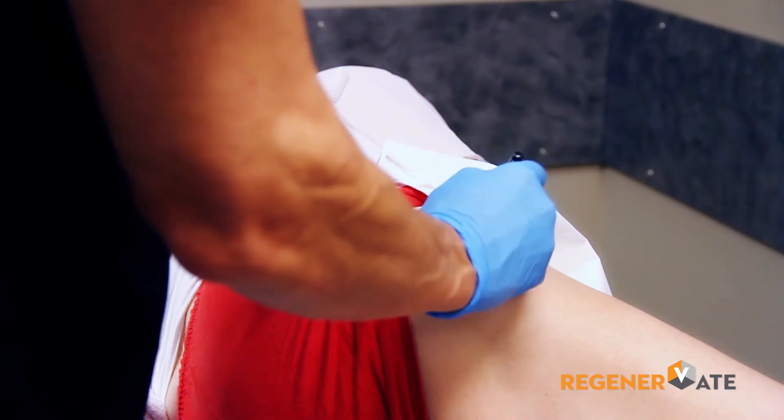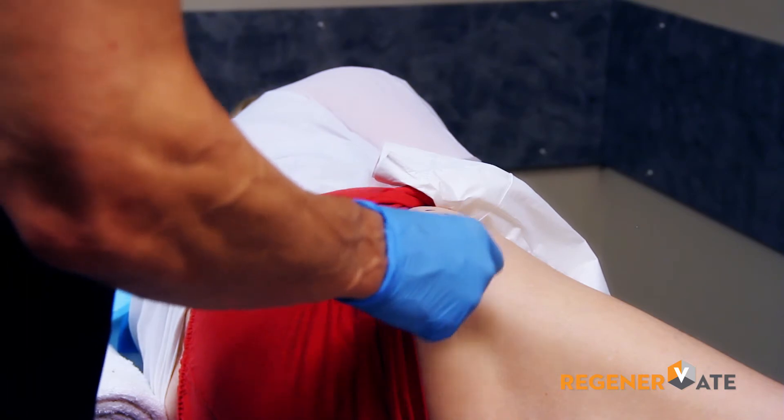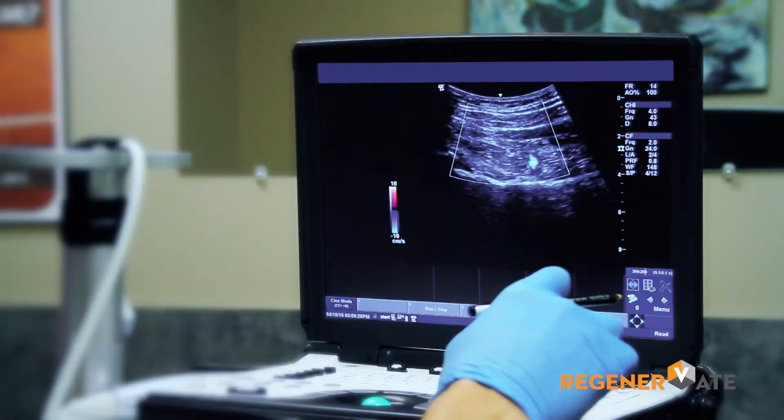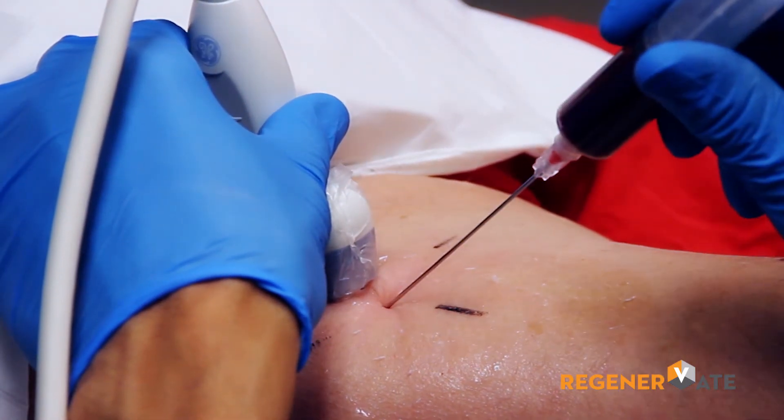Once we have platelet-rich plasma ready, we focus on the patient in terms of marking the target area using ultrasound guidance. Once we have our target area mapped out, we guide the needle in again under ultrasound guidance and we inject.